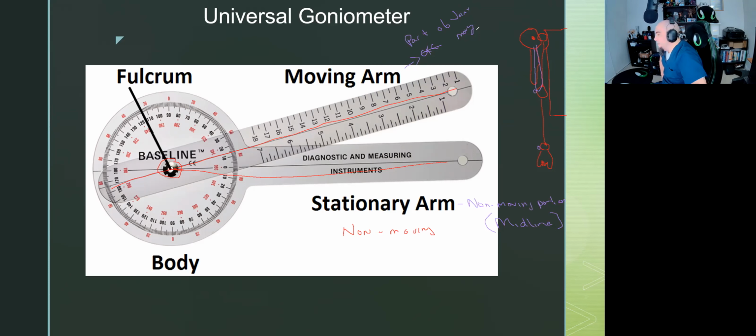But typically we're always going to measure from the lateral side or the anterior surface of the body. Because if we're doing abduction, it's typically anterior surface. But typically we stay lateral. But I know that when I teach you guys how to measure shoulder flexion, somebody in here that's a tech is going to say, but Mr. McKeever, I've seen my PT measure shoulder flexion seated. And that's not wrong. That's just not by the book.